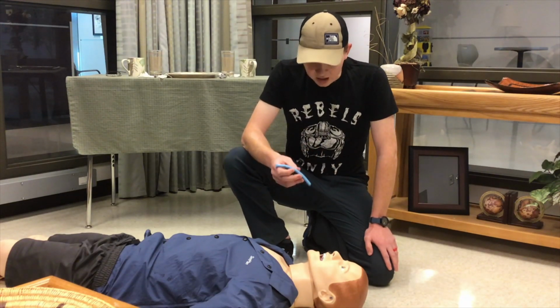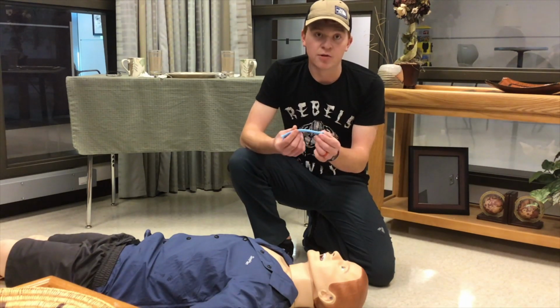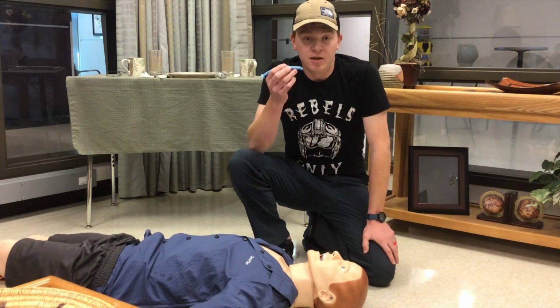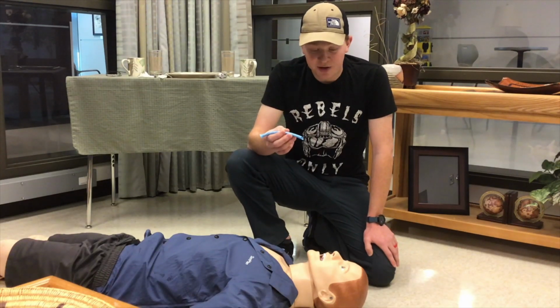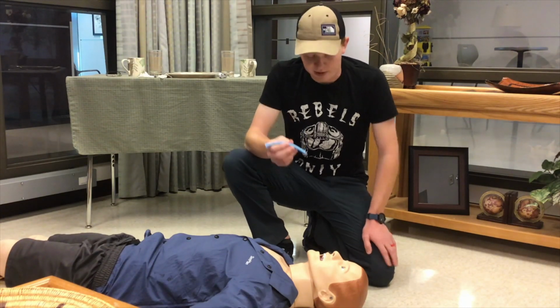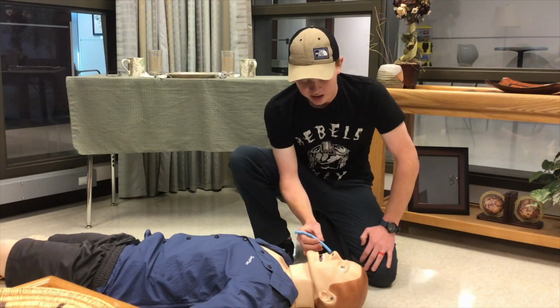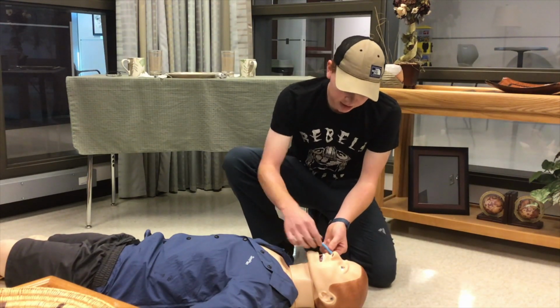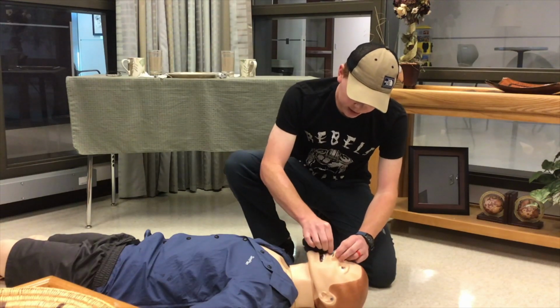One thing to keep in mind is that the bevel needs to go towards the septum, or the midline of the patient, at all times. So if you're going in on the left nostril, you would have to rotate the NPA over. So we'll be using the right nostril to avoid needing to rotate, and we're going to go ahead and insert the NPA into the patient's nostril.